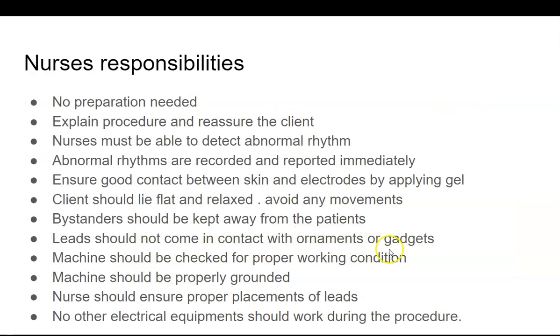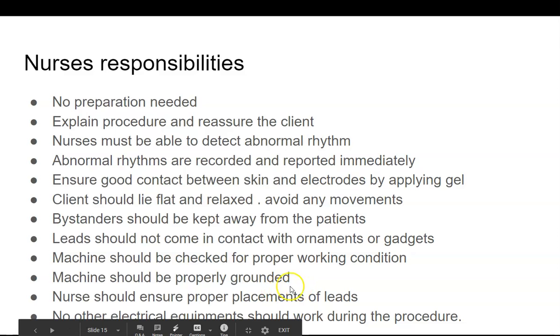Leads should not come in contact with ornaments or gadgets. Don't tell them to remove the ornaments and all, because ECG is a very basic procedure, but you can tell them not to touch ornaments or gadgets. Gadgets are better moved out. The machine should be checked for proper condition before bringing it to the patient's bedside. It should be properly grounded. The nurse should ensure proper placement of leads. No other electrical equipment should work during the procedure. Once the procedure is done, wipe off the gel, make the patient comfortable, help him in dressing himself, and make sure you replace the equipment properly.